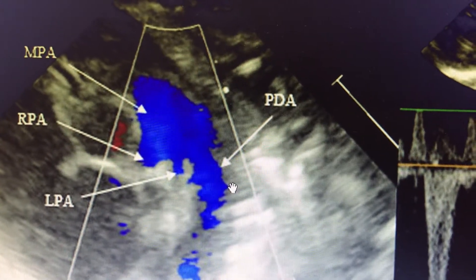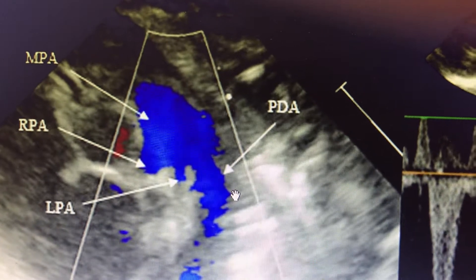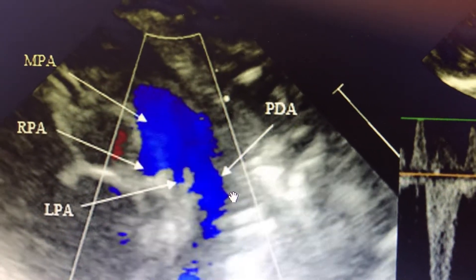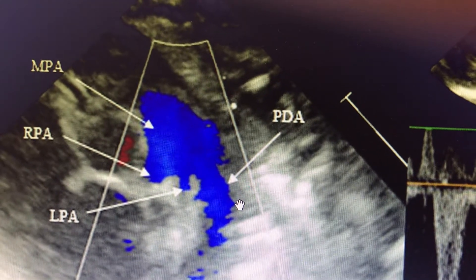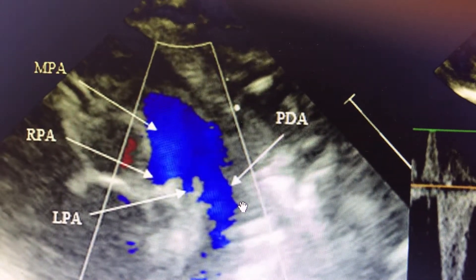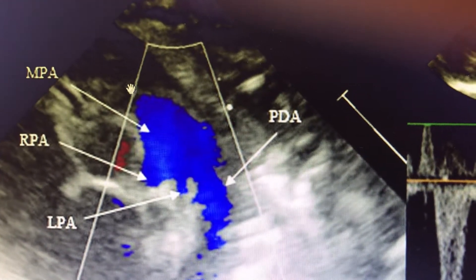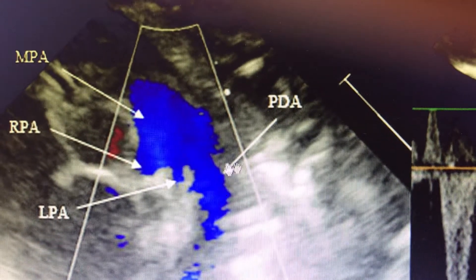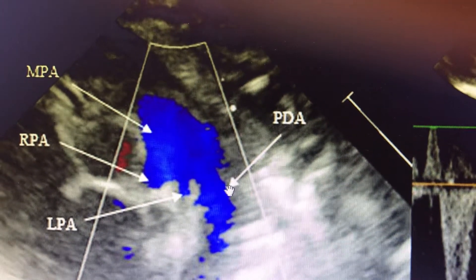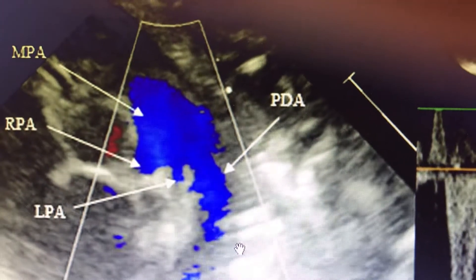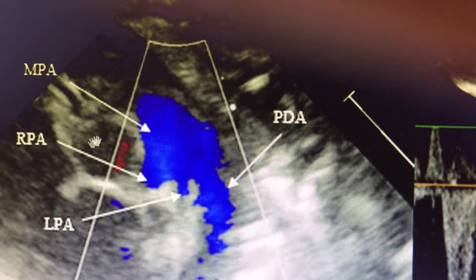Here are examples of right-to-left shunt across the PDA. Usually right-to-left shunt is very rarely seen — either very early after birth or in advanced Eisenmenger syndrome, you can get a pure right-to-left shunt. Here you can see that the right-to-left shunt is present because the blood is flowing into the descending aorta. The blue color signifies that blood flow is away from the cursor. This is the PDA; you are seeing the main pulmonary artery and the aorta.